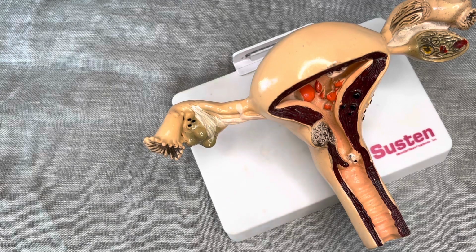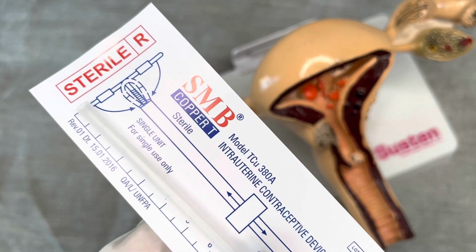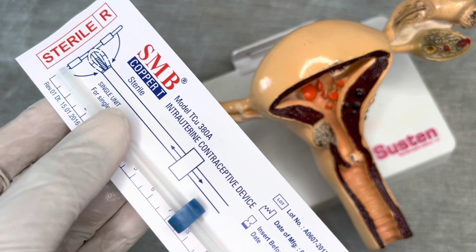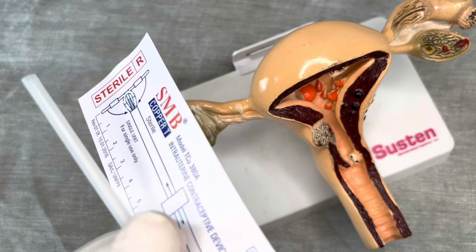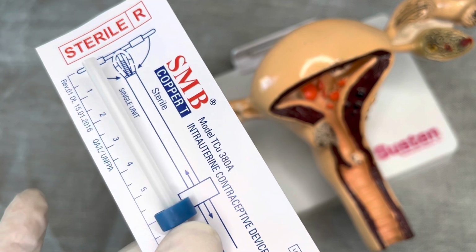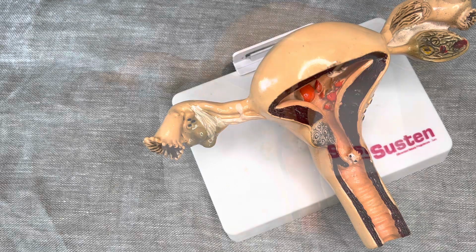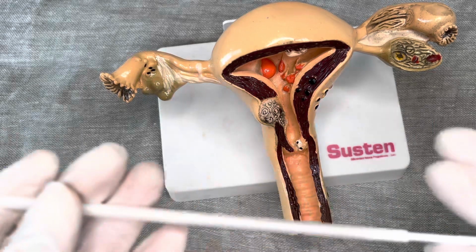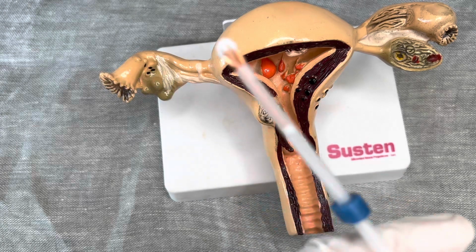You see this thing, before I insert the copper T wire, I'll have to measure. So we said 6, right? So it's 6, so I put it straight there until here. I'll have to move this blue thing up until 6. You can see that. So once I've moved it, now it's time to do the insertion process. The insertion process is very, very easy. You can see the complete set is supposed to be like this, because this is the thing that will push it in, and this is how it looks.